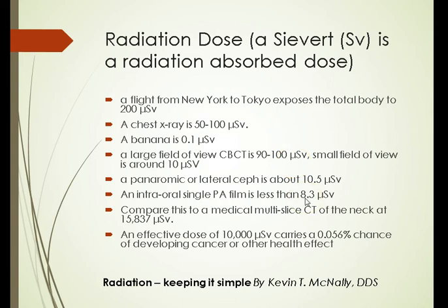That's pretty impressive. Now, compare this to a medical CT, non-cone beam CT. The radiation dose is 15,000. And here you can see, when a patient says, I already got a CT from my doctor because I had headaches and whatnot, well, tell them, look at the difference.